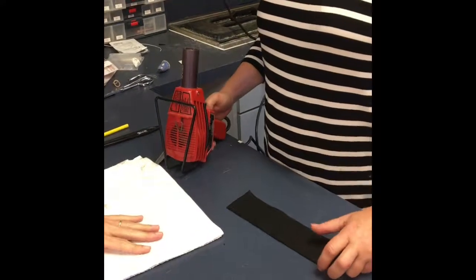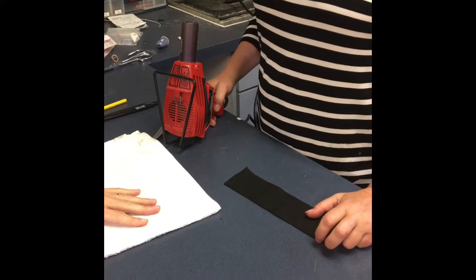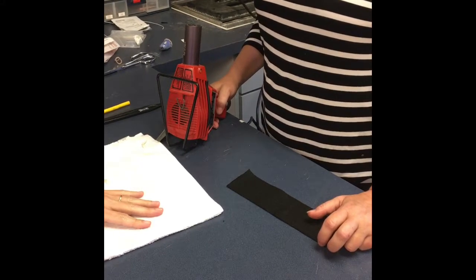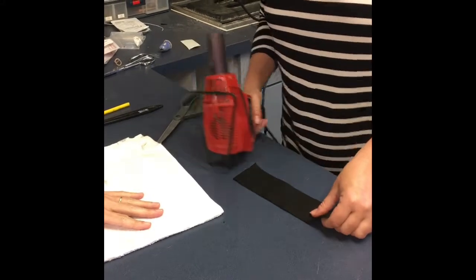Long mallet finger orthosis. This is especially beneficial in patients who have either hypermobility at the PIP joint or a pre-existing swan neck deformity.